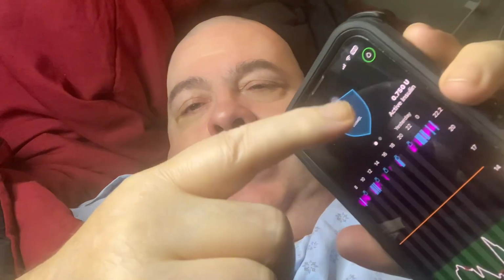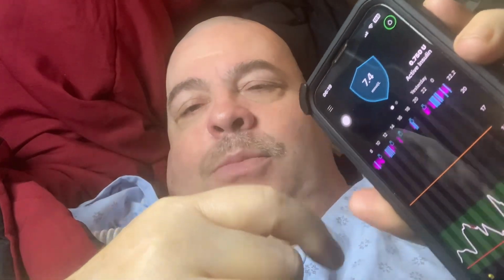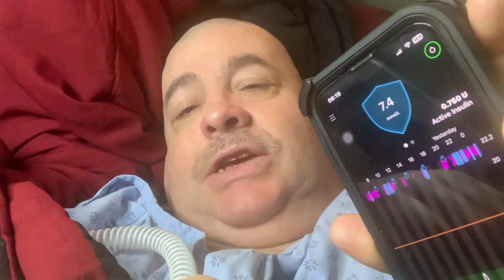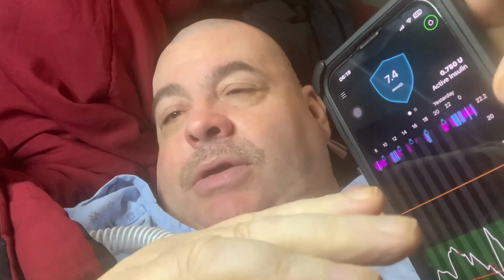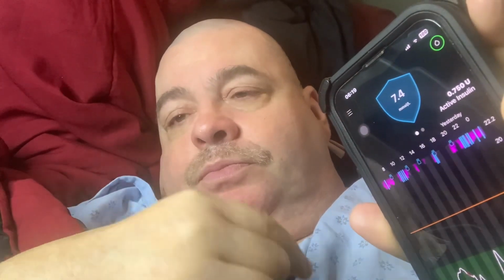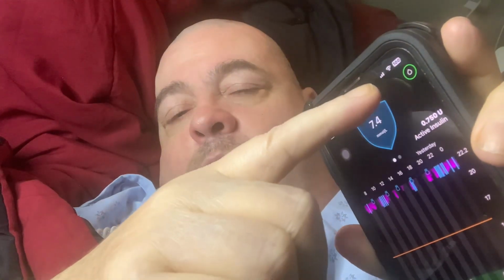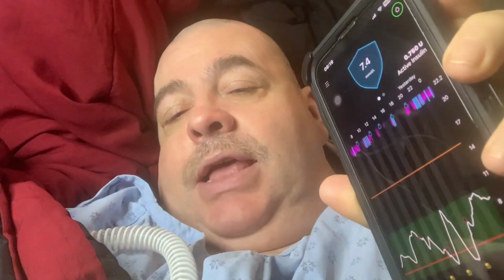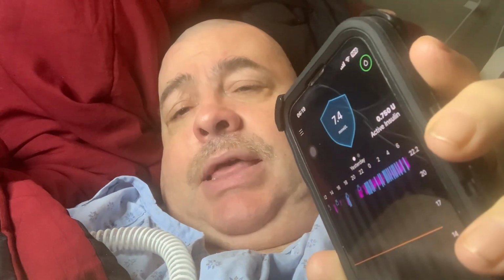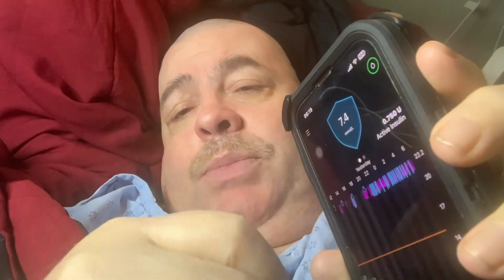Yes, let's take a look at blood sugars. That little dot is a cursor thing I can move around. Current blood sugar is 7.4. It's actually 7.7, but you don't get too upset if you never match what your glucose meter says. We're fully calibrated. It took a while to calibrate. I started this video and found out that my two weren't synced. So I calibrated. It took a while, and now we're back.